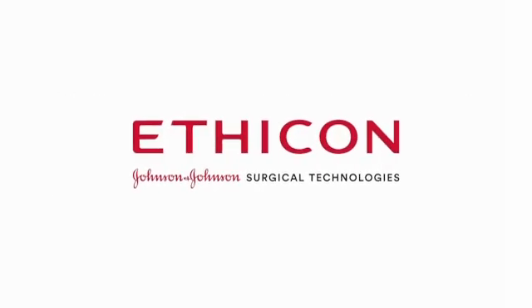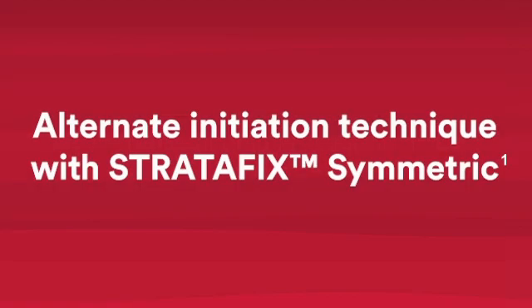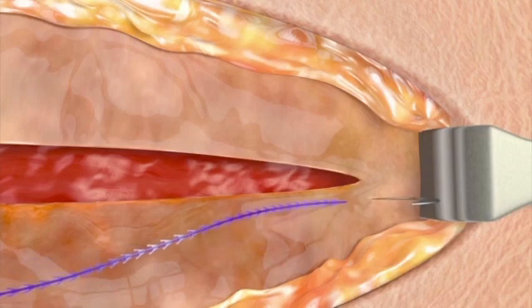Stratafix Symmetric PDS Plus device is designed for use in continuous suture patterns without the need for anchoring knots to begin or terminate the incision line. To seat the fixation tab, take the first pass in intact tissue adjacent to and in a direction away from the incision, a couple millimeters away from the incision line.